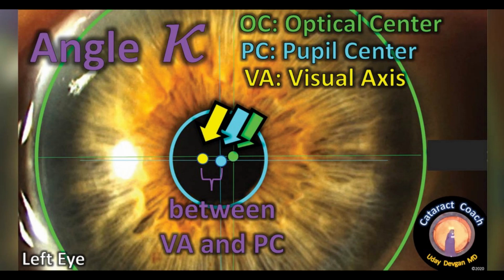Basically, if you look at this diagram, which I have borrowed from cataractcoach.com, that is Dr. Uday Devgan, it shows us the reflex which forms on the cornea when the patient is looking at an illuminated pointed object. So these are the reflexes, and this is the left eye, and we can see there are three reflexes here, and each one of them denotes the optical center, the pupil center, and the visual axis. The optical center and the visual axis have to coincide as closely as possible, and only then can we have a patient who is fully satisfied.